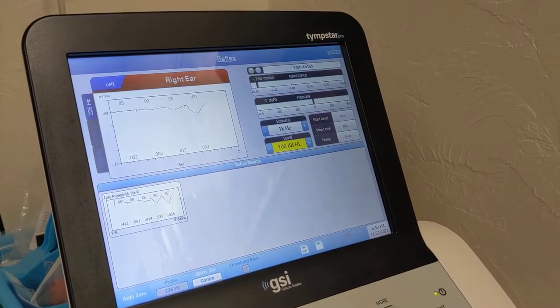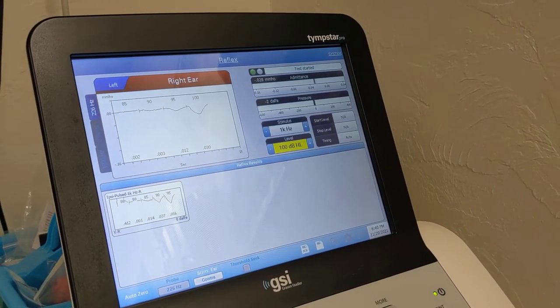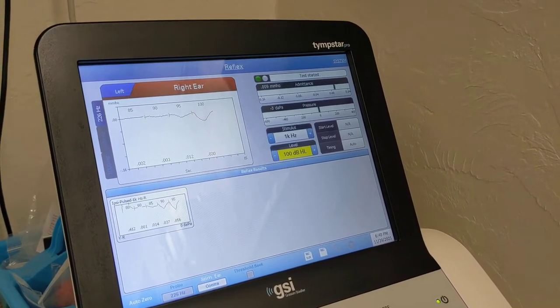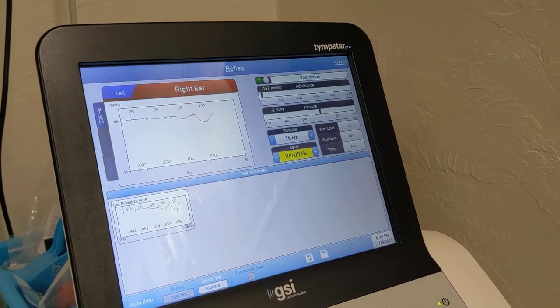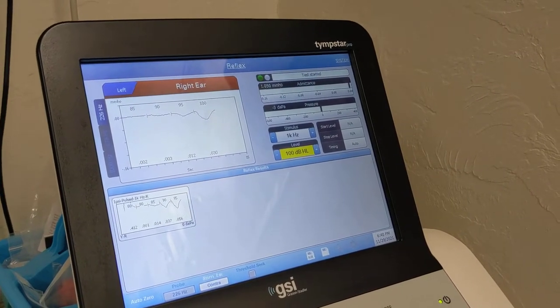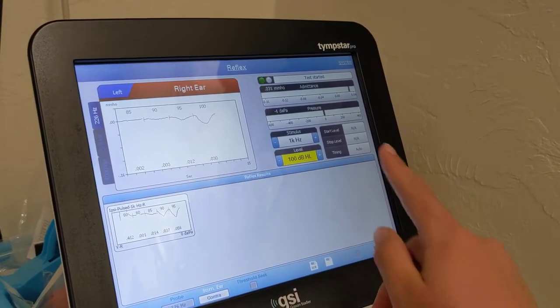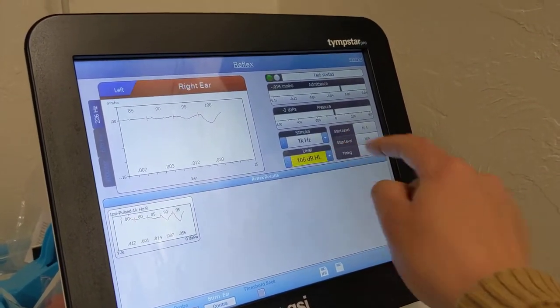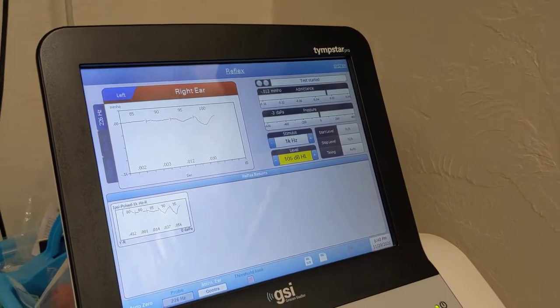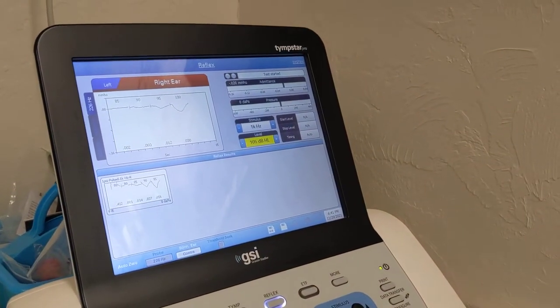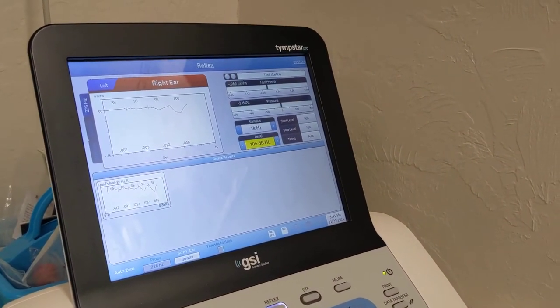All right, so we got 0.03. So that means that it is present at 100 dB for Contra and let's go up 5 more. It's starting to get loud, but let's do it anyways.